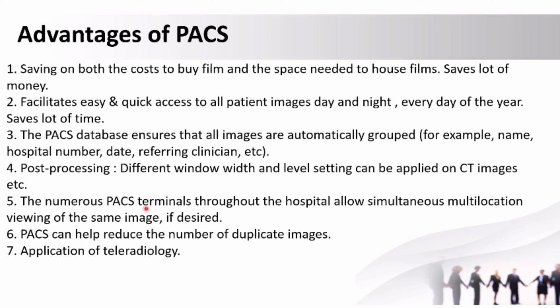Then we have numerous PACS terminals throughout the hospital, which allow simultaneous multi-location viewing of the same image if desired. Like if someone is sitting in the radiology department, a person in the surgery department can also view the same patient by entering the ID. Next, PACS can help reduce the number of duplicate images. It is an application of teleradiology.